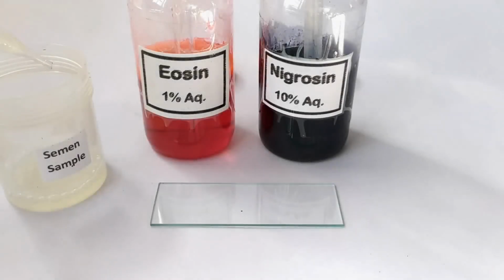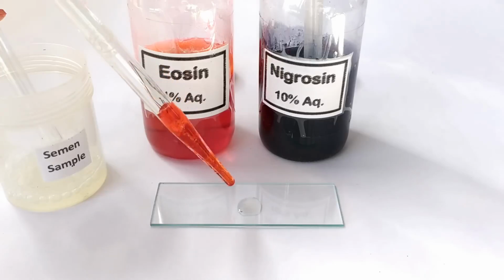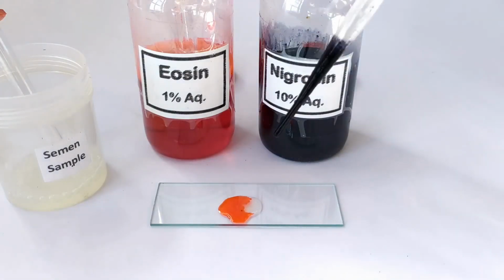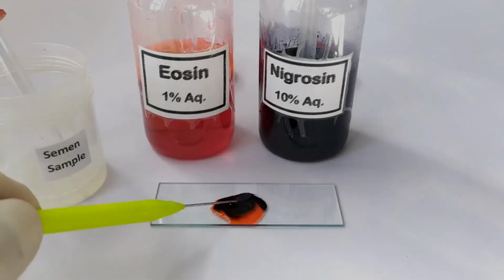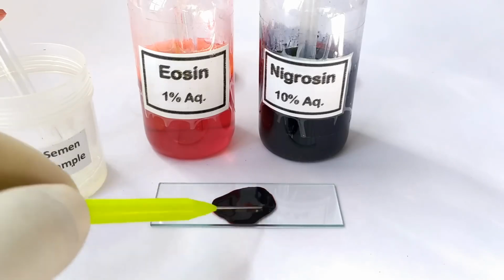A drop of liquefied semen sample is taken on a glass slide. 5 drops of eosin nigrosin stain, or 2 drops of 1% eosin and 3 drops of 10% nigrosin stain, is added to the sample. The stain and the sample are gently mixed on the slide and allowed to stand for 10 to 20 seconds.